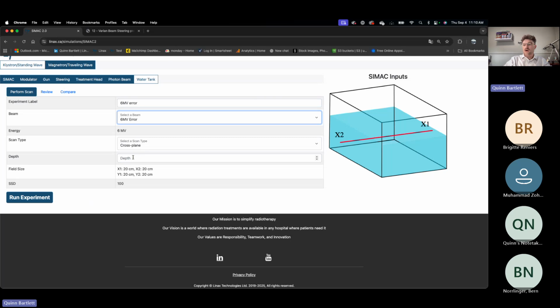cross plane, and we'll do the depth of, what's Dmax again, 1.9. Or I should know what Dmax is, but we can just do it at 10 centimeters. And then we'll run this experiment, and then we'll be able to run the other two quickly after, and we'll be able to see.